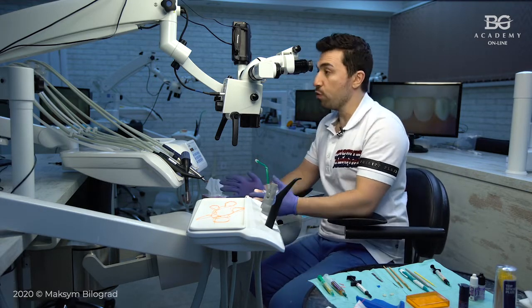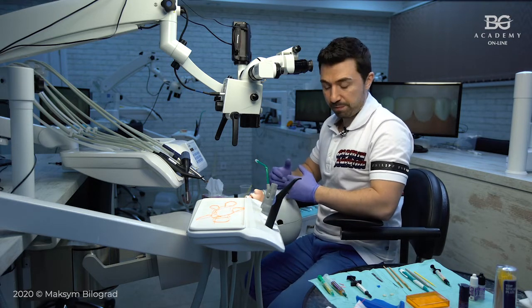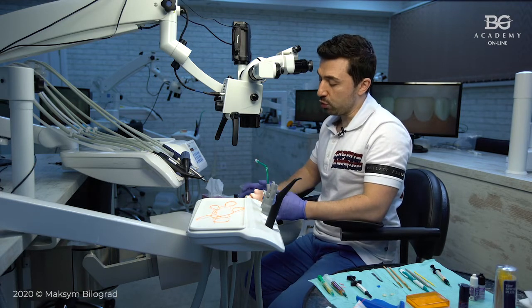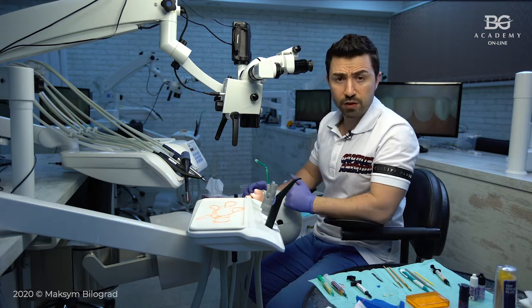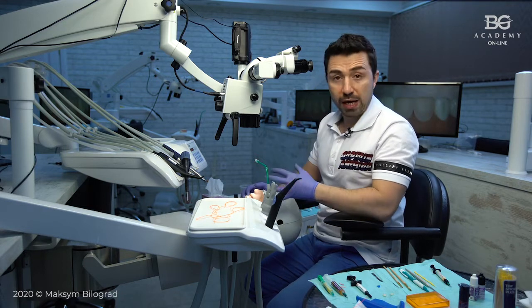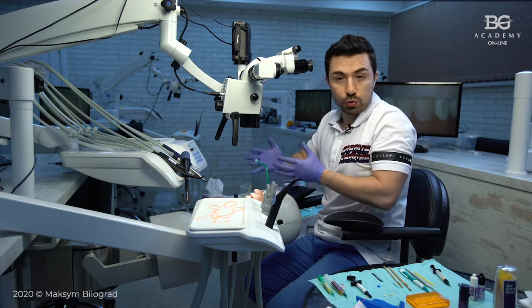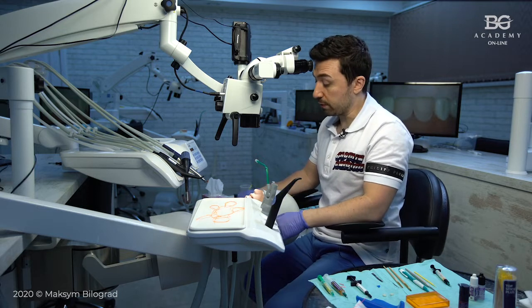Once we remove provisional restorations, personally I do spot etching and spot bonding for provisional veneers to stabilize them for the long term, because from 1 week to 2 weeks the patient can have these provisional restorations from our side.